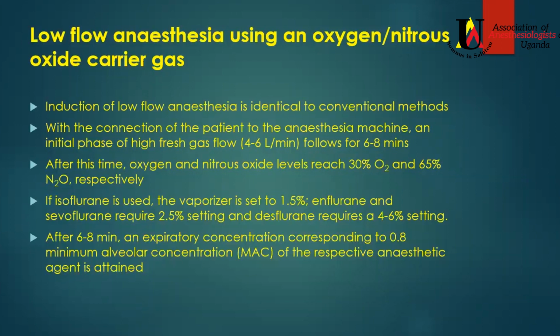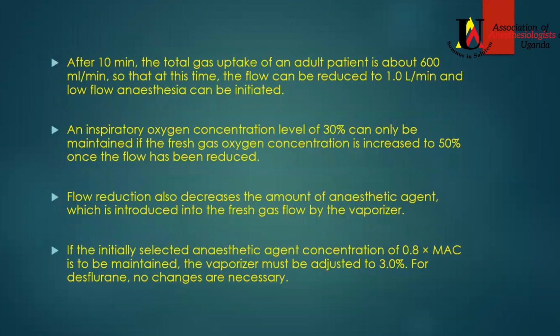Now, once you achieve that, you can start reducing. So after around 10 minutes of running your nitrous and your oxygen, you reduce your flows to 1 liter per minute, and you can start your low flow anesthesia.